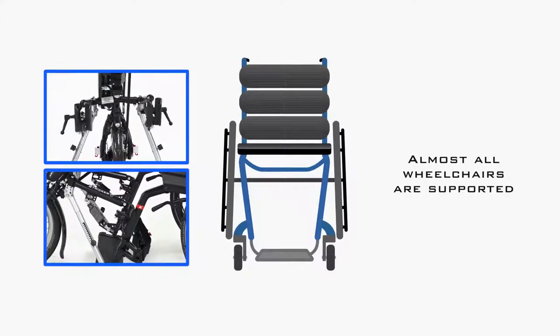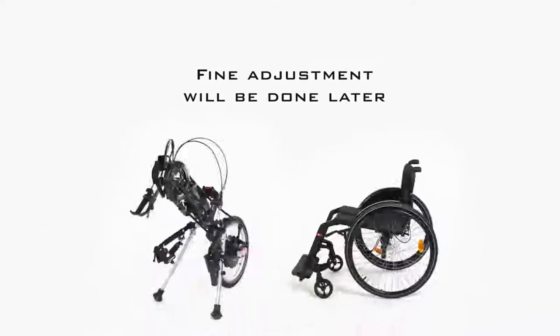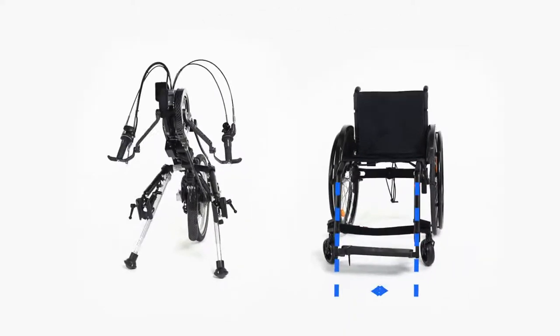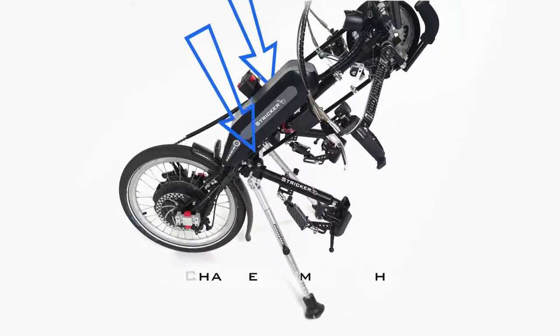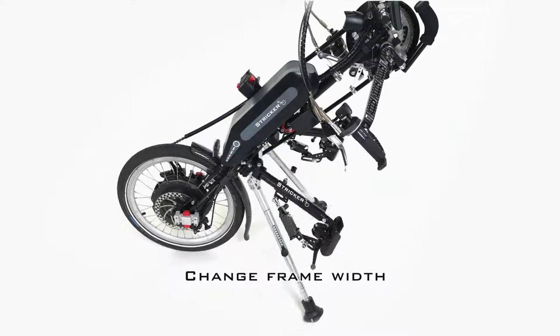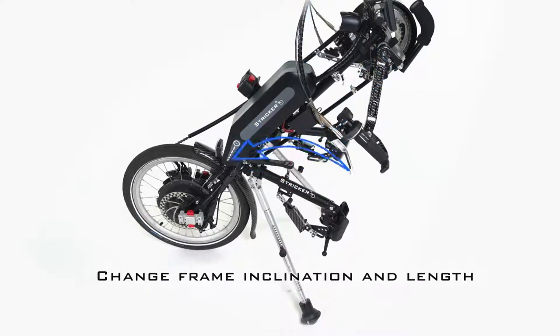Thanks to our universal clamps as well as the adjustable frame, almost all wheelchairs are supported. We will do the fine adjustments later. First we roughly adjust the frame width to your wheelchair seat width. To do this, open the two frame screws on the corner brackets to change the frame width, then open the two screws on the longitudinal tubes to change their inclination and length.